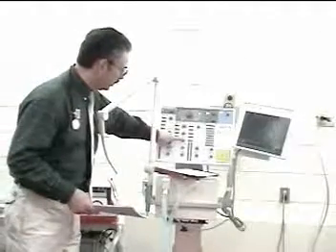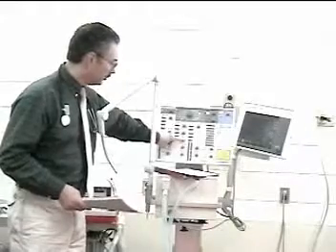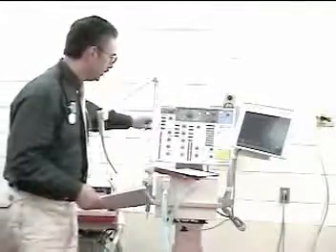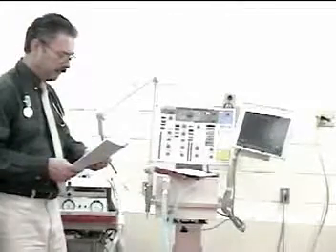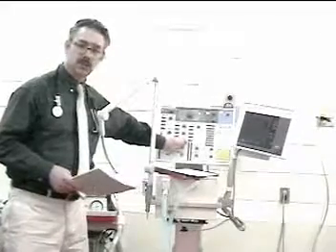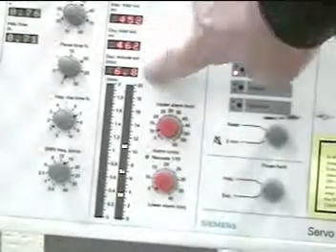The inspiratory pause time percent and inspiratory I-time percent are controlled by two separate knobs. Record those settings and physically verify that the dials have not changed. You also have a digital readout of the actual minute volume.